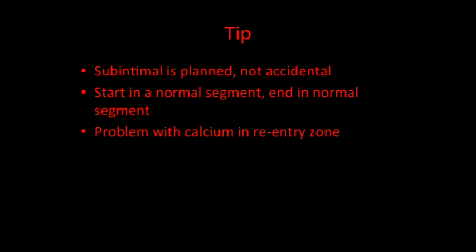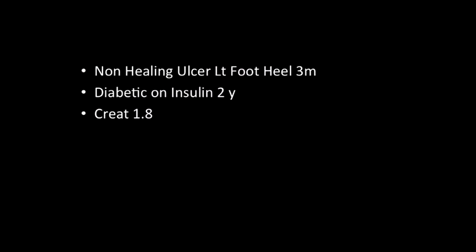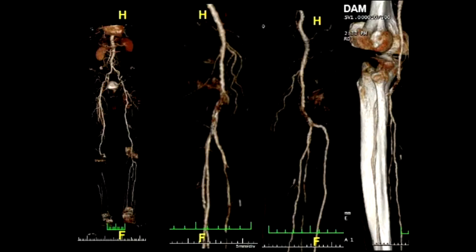So this is a case to illustrate a different point. Terribly, the patient had to undergo amputation of the opposite side. This side he was having rest pain. You can see it's terrible. I mean, distal SFA occluded, single vessel runoff, peroneal, dorsalis pedis barely seen, multiple lesions. Anyway, I'm going to skip this video. Okay, so anyway, we got across the occlusion.